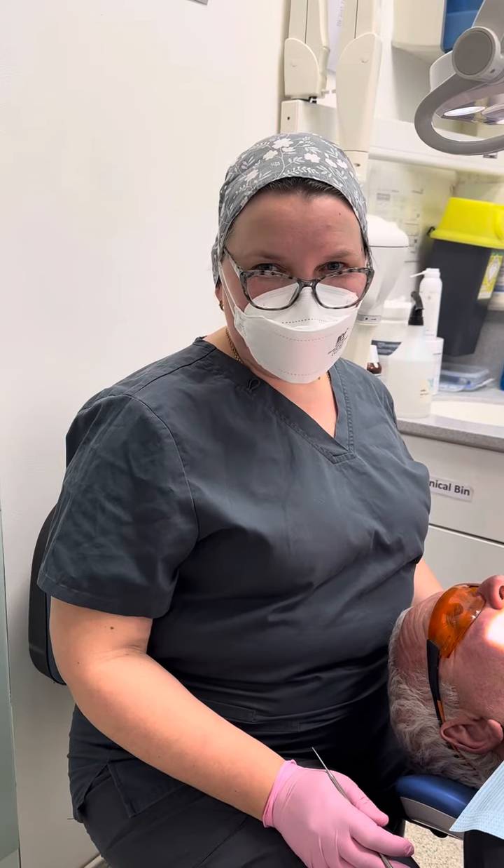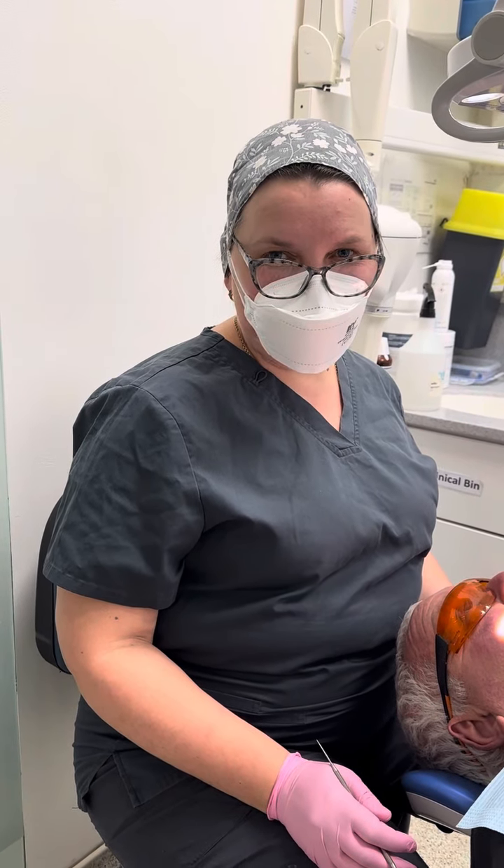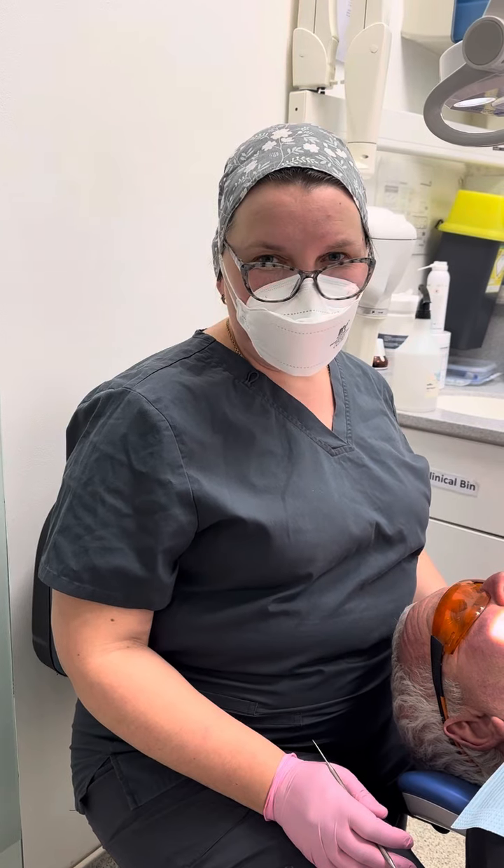Hello, I'm Dr. Anna. I'm fitting the porcelain bonded bridge for my patient. It's a four-unit upper front porcelain bonded bridge.